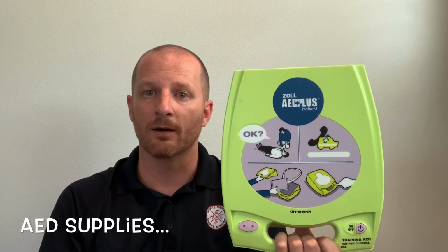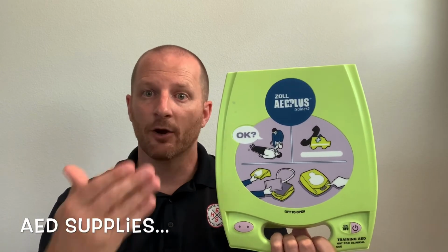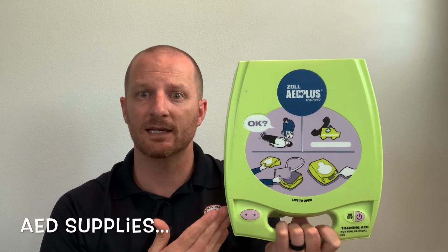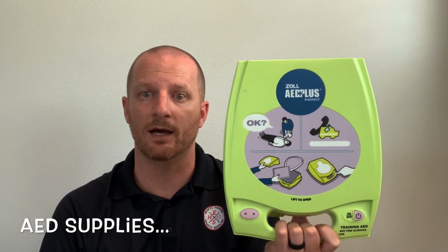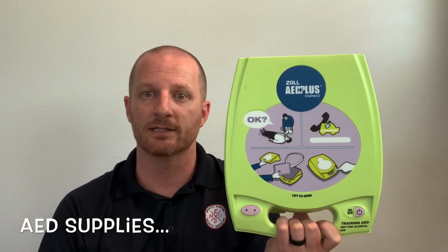We can then do our mouth-to-mouth breathing over this mask to let air go in, but nothing to come back towards us. Again, this is going to save somebody's life, so we want to ideally get it to them as fast as possible. And again, it's going to double the chance of survival.